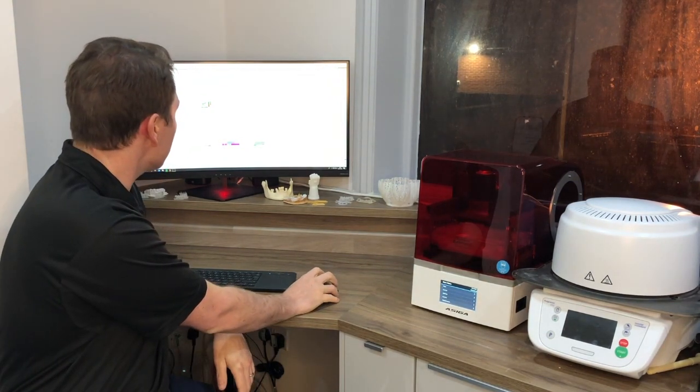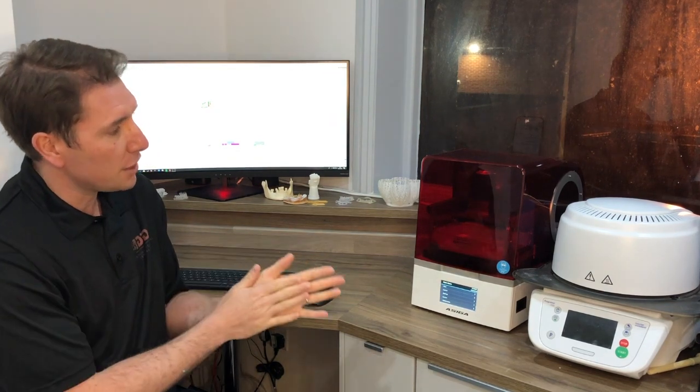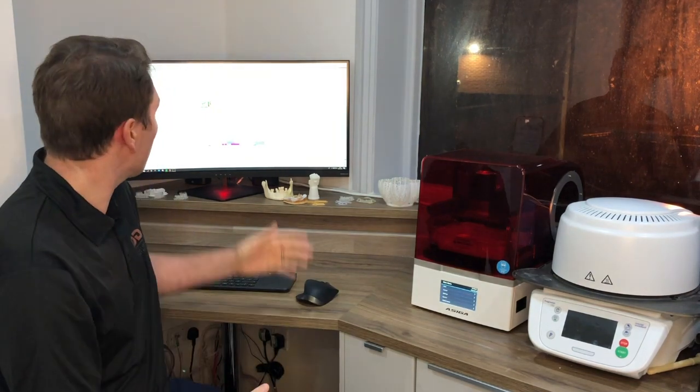The separation detect and the anti-aliasing it has gives me a much better finish on the model, especially for wax-ups and 3D smile design. Also, the separation detection means failures are very, very rare — I think maybe one out of 100 — which is so impressive compared to other printers I've used.